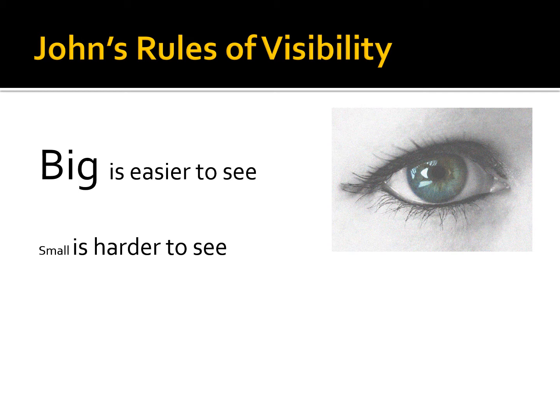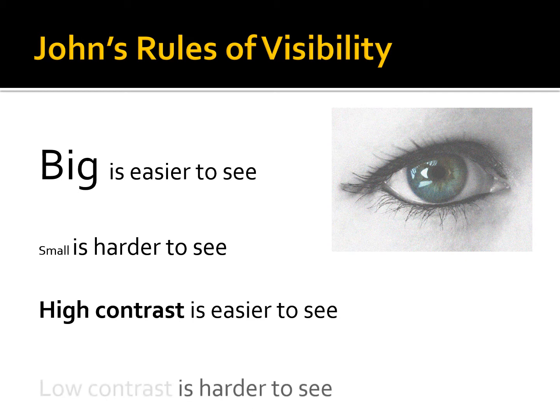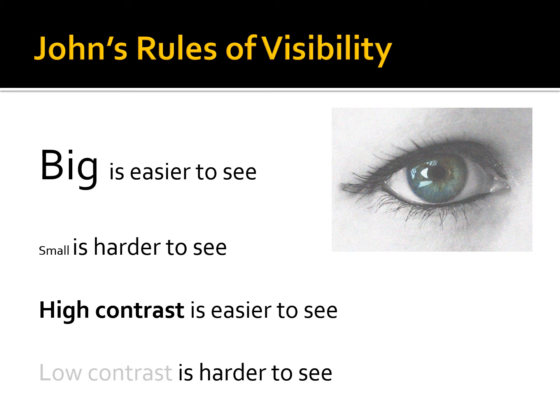in size. The more the density of an object differs from adjacent or underlying structures, the easier it is to record or visualize. An object can be darker or lighter than its surroundings. The importance is the amount of difference. Again, the obverse of high contrast is true. The reason we don't see blood vessels on standard radiographs is that they have density similar to the surrounding tissues and are not visible without enhancement or contrast media.